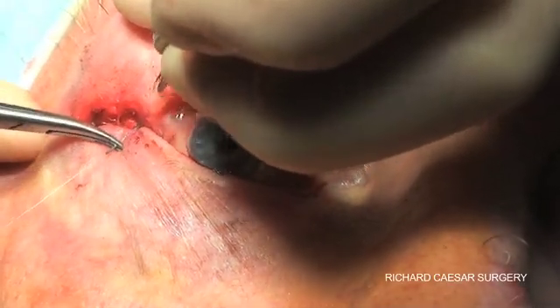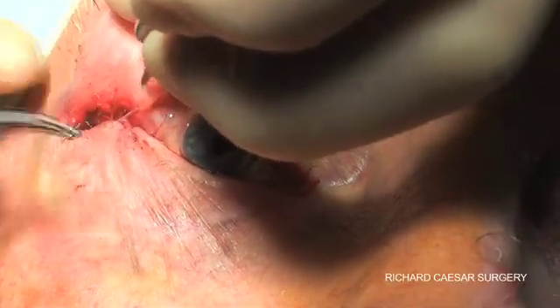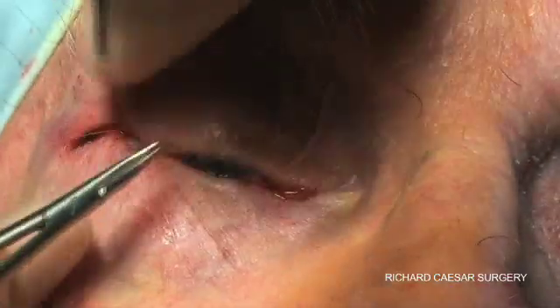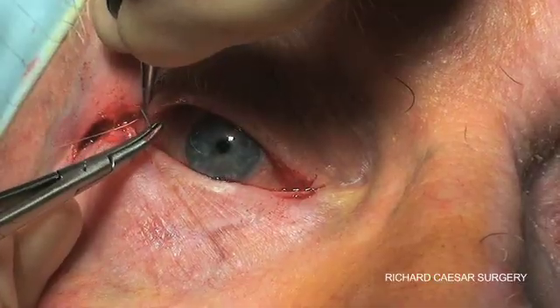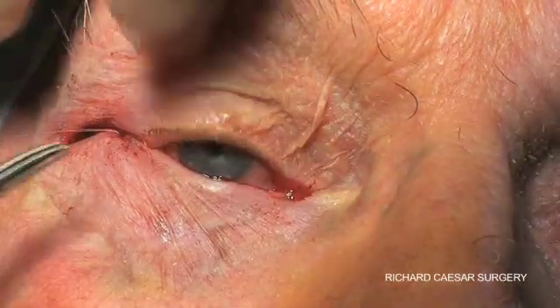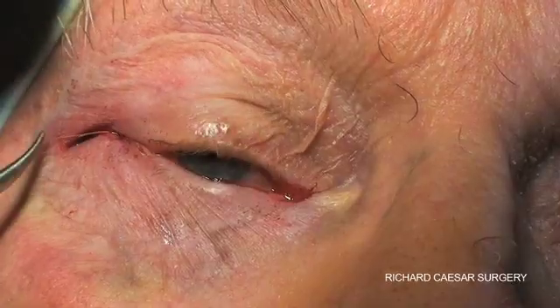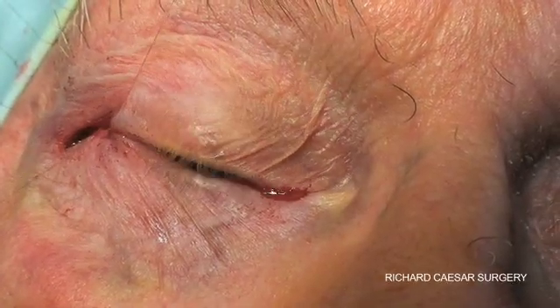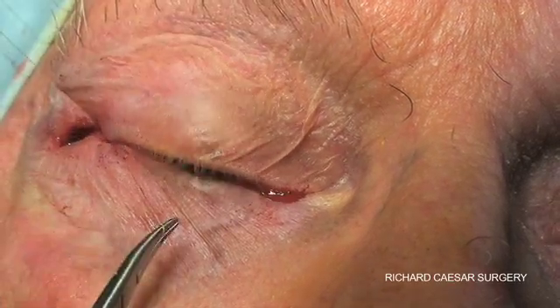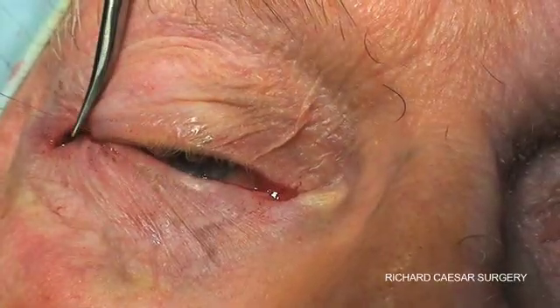Then a commissuraplasty goes from inside through the grey line. This is one of the few times that I place a suture in the grey line and then back in such that the knot's buried. I've tried tarsal strips both with and without this suture, but I find you get a much sharper canthal angle with this suture in place, although some authors have suggested that the suture doesn't sharpen the angle much and is just a little uncomfortable. However, in my hands this definitely gives a sharper lateral canthal angle.